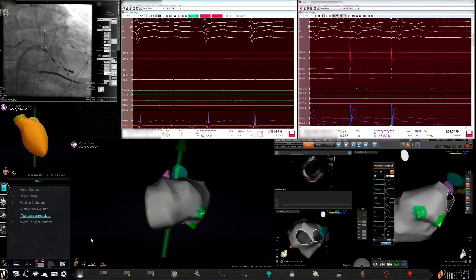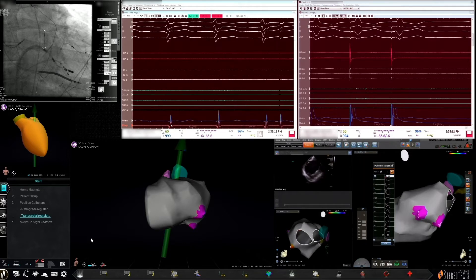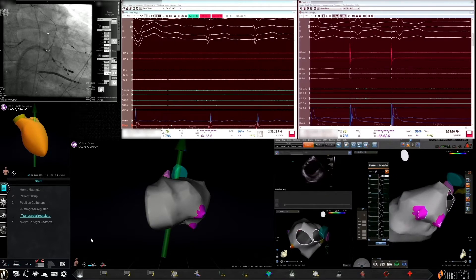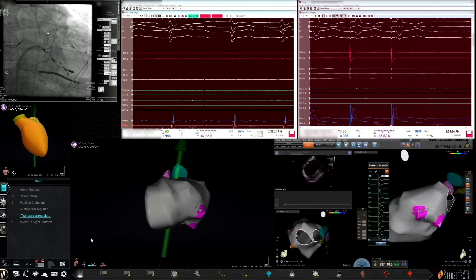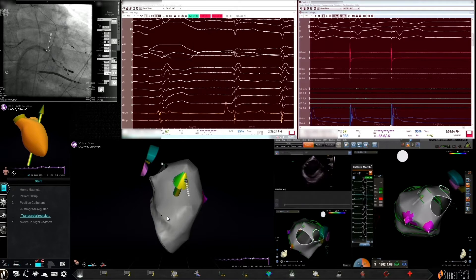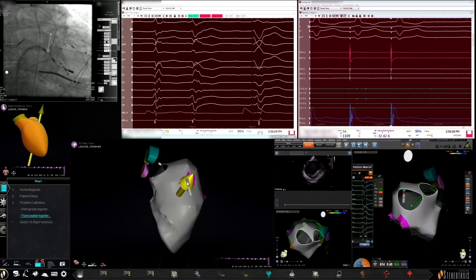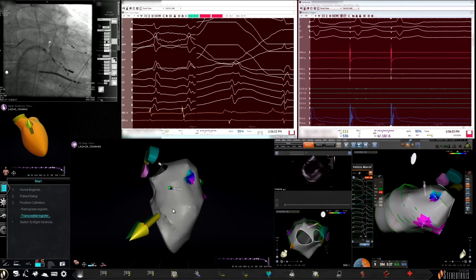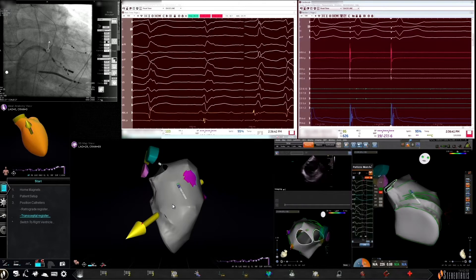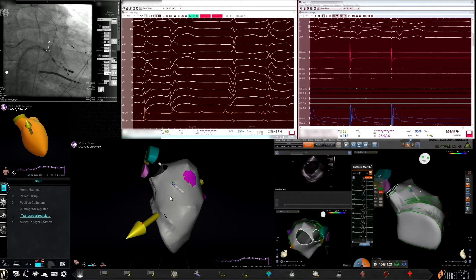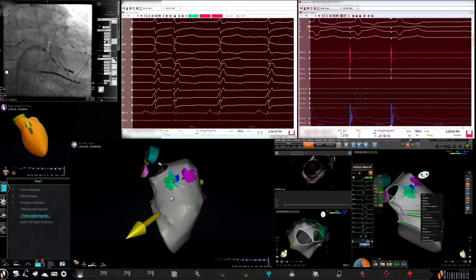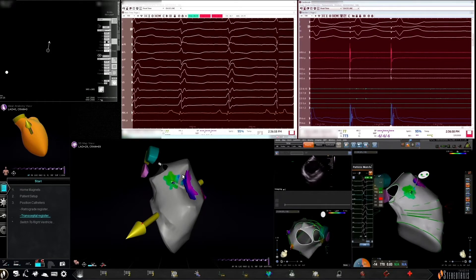This patient's clinical ventricular tachycardia resulted in immediate ICD shocks with a rate that would not be mappable without the use of either an Impella or ECMO. Given his age and comorbidities, a substrate modification approach was taken in this case.